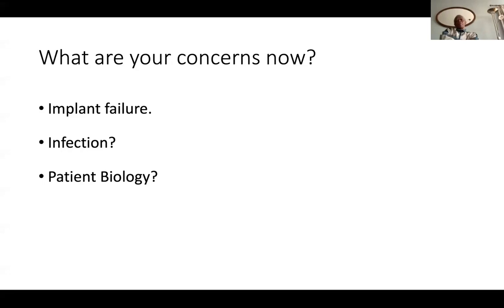So where is this force coming from if the patient is not weight bearing? If the patient is weight bearing on the non-affected limb, just the weight of the non-weight bearing limb gives cantilever bending at the fracture site. Then also the deforming forces on the fracture fragments also load the implant.